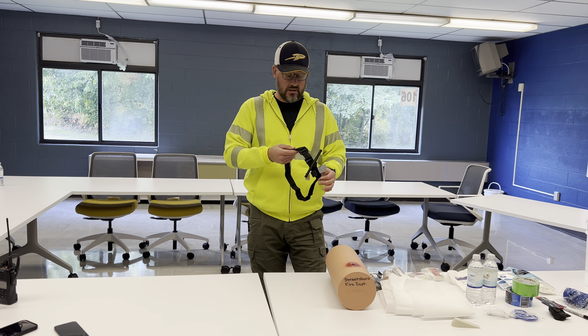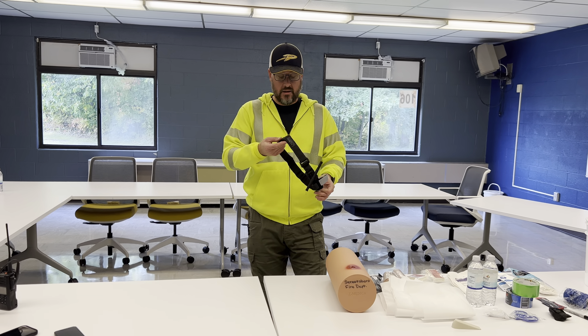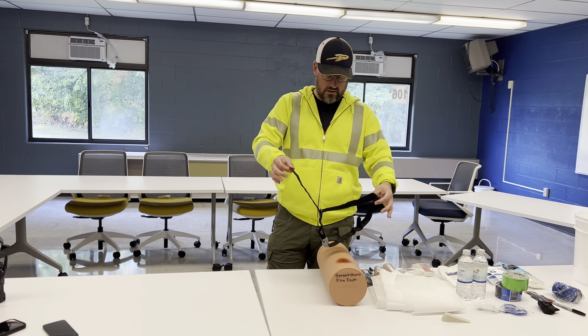That's okay because we're near hospital-grade medical care, so we're not too worried about using tourniquets in this context. The way they come staged, they're on top of your go bucket, and you may need to take them out and undo them depending on the situation. In this case, we're going to simulate a leg. The reason they're set up as a sling already is so you can just thread them up the leg of the person you're treating.